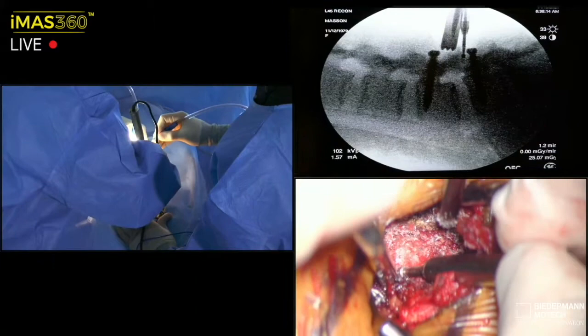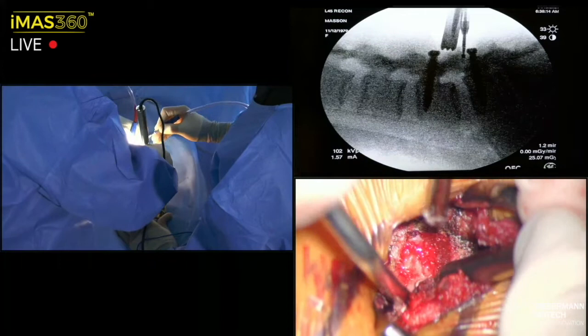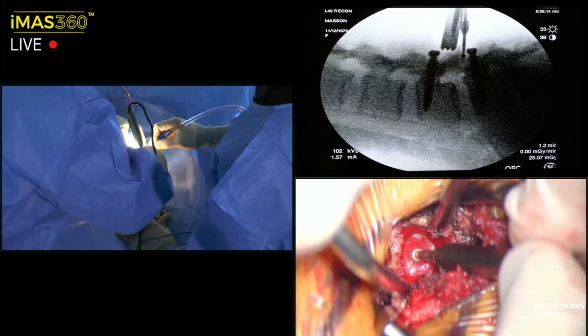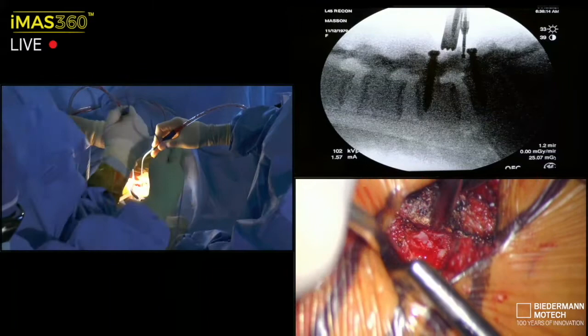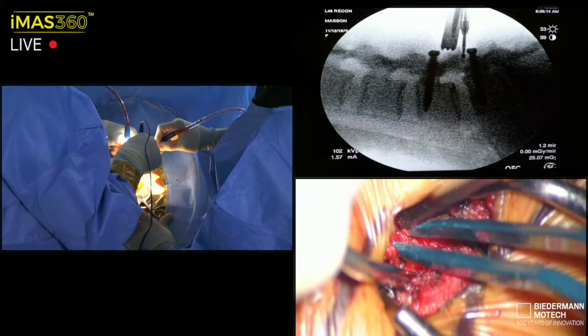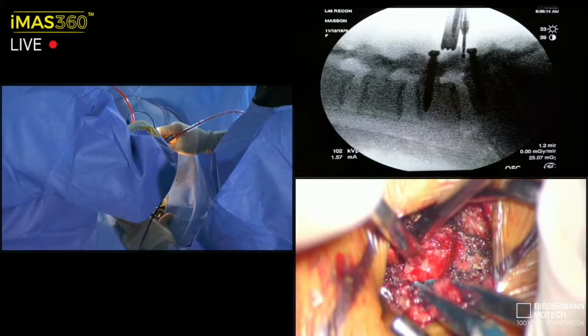And so again, coming vertically, three zones. The high zone is the facet zone, the deep zone is the foraminal zone, the final zone is the disc space zone. As we get to the foraminal zone, that's where we run the risk of the thecal sac and or nerve root. So that's the braking zone. Facet zone, if you're lateral to the medial limit, is a full throttle zone. It takes extreme clarity of awareness and being comfortable with where you are to know the difference between a braking zone and a full throttle zone.